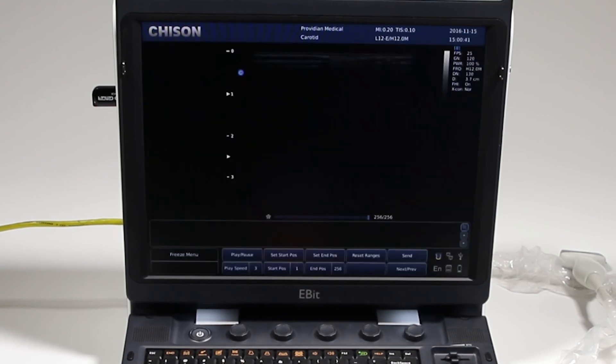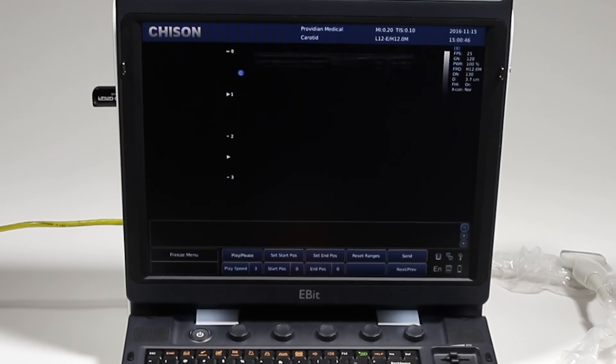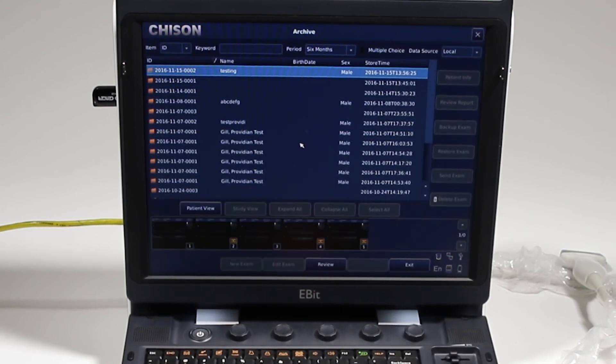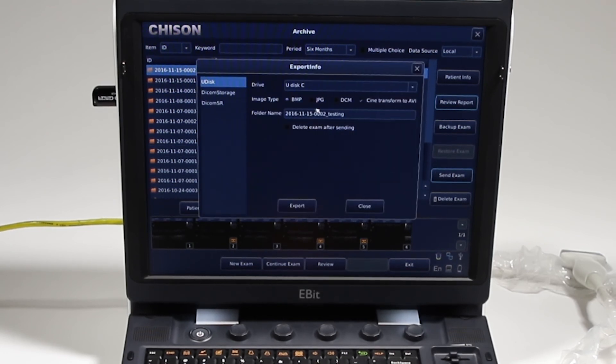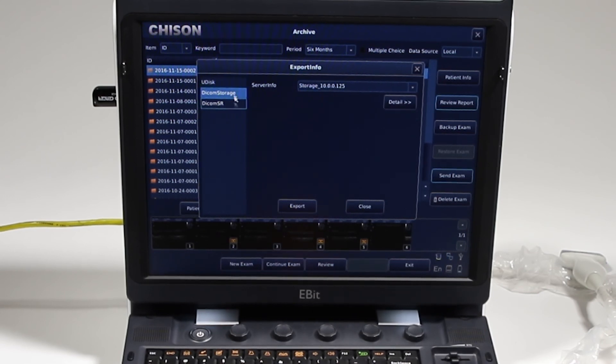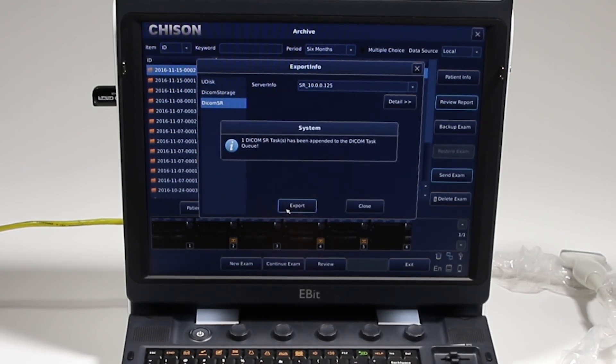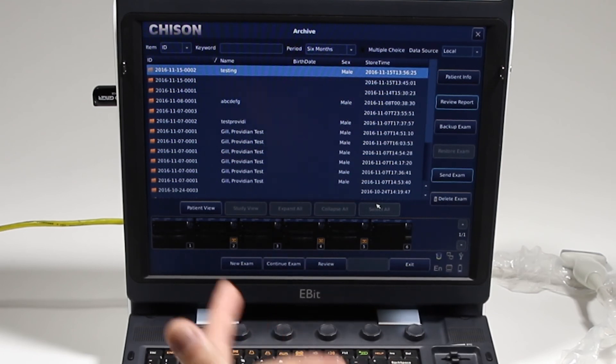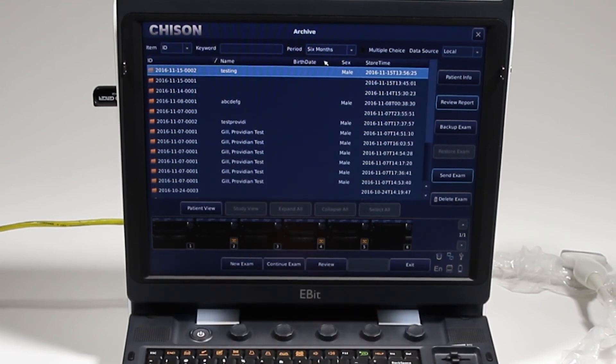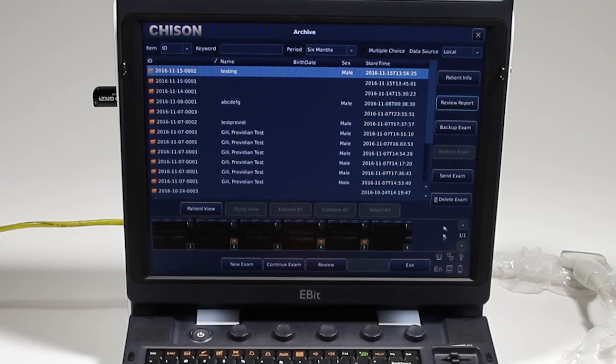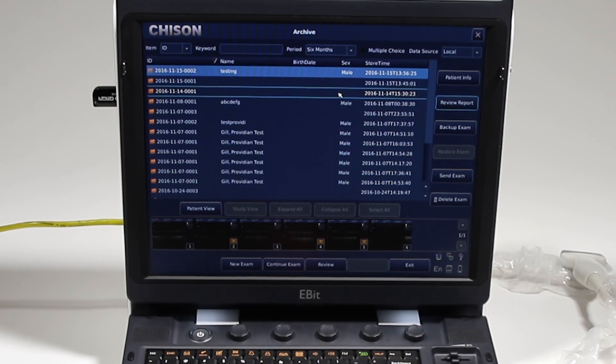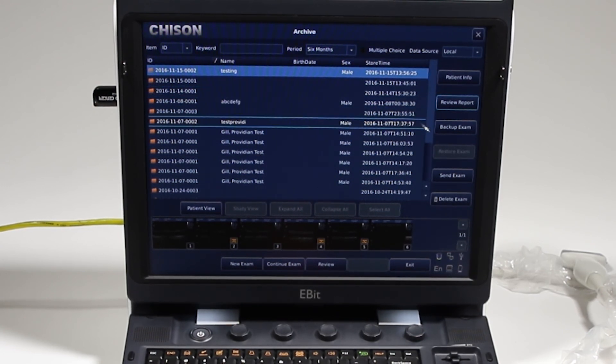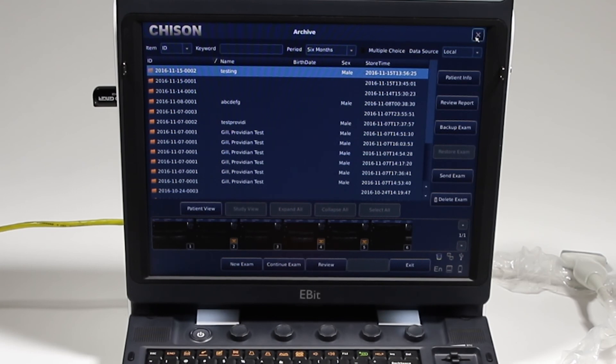Go to my archive, and if I want to go ahead and send that structured report, you send exam. And the first time I chose DICOM storage, the second time after that's complete, it's really simple because you stay on this screen. Just click DICOM SR and click export, and then it's going to go ahead. You can even go ahead even while it's exporting and the queue is in the background. Like I showed the DICOM queue, I can just go back while it's sending. I can still go ahead and send that DICOM structure report. It's pretty simple. In the future they may add a little check box to say that you can do that, but it's not the case at this time.